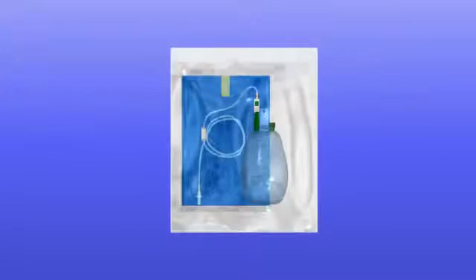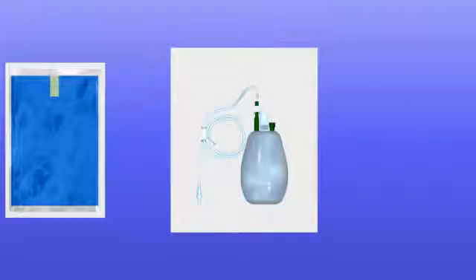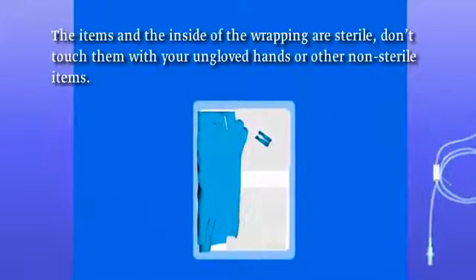Peel open the drainage kit pouch all the way and remove the procedure pack. Leave the bottle on top of the pouch. Open the procedure pack by peeling the front and back of the pouch apart, starting at the top. Place the procedure pack on your workspace. Remove the tape and unfold the blue wrapping. Leave the enclosed items on the wrapping. These items and the inside of the wrapping are sterile. Don't touch them with your ungloved hands or other non-sterile items.